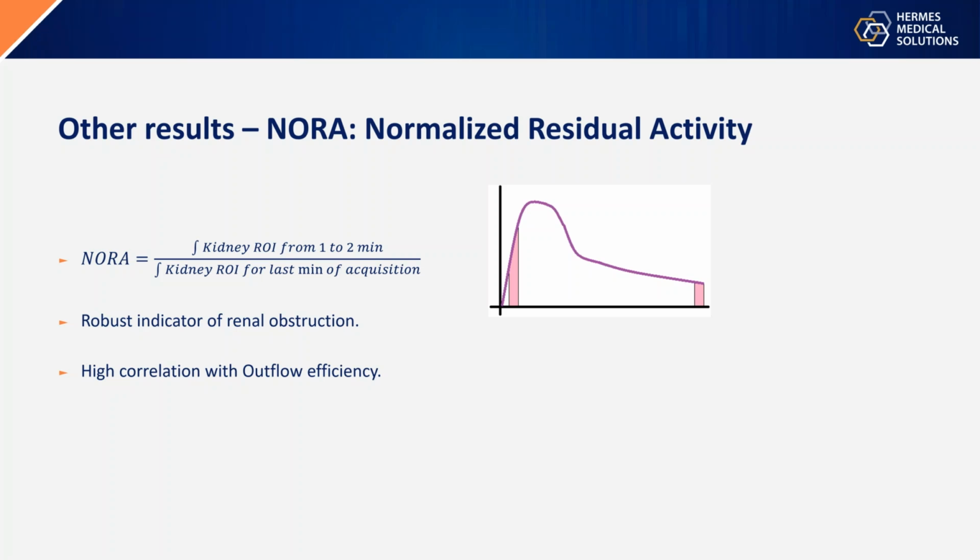The reason is that when we do the Patlak background subtraction, we do it as an add-on, meaning that the C-shaped backgrounds will, as I said previously, under-subtract the images, but we won't over-subtract with a large margin if we include the vascular background subtraction from the Patlak.